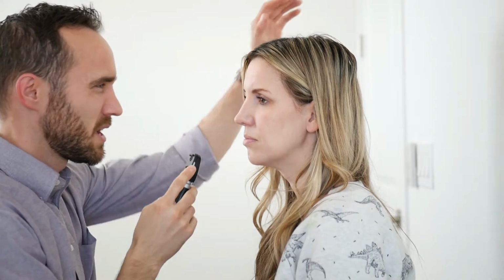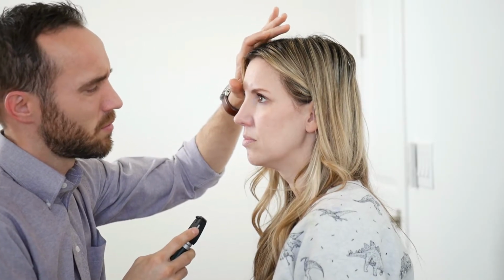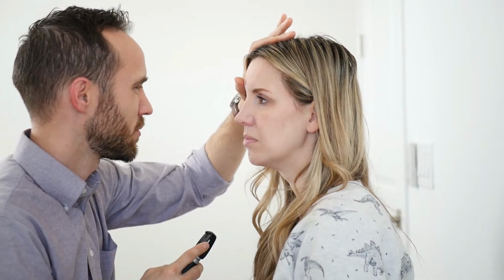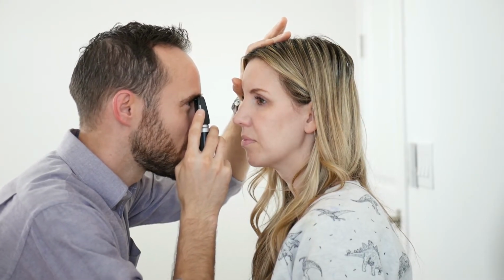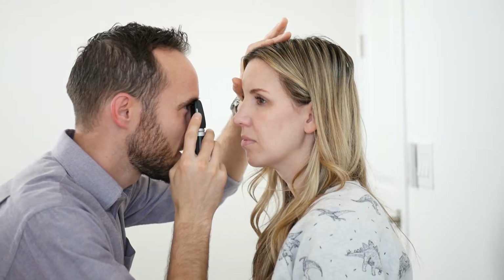So at that higher diopter, I'm looking at the anterior portions first, and I'm going to cover the right side of her brow with my left hand, and I'm going to observe with my right eye. First, anterior portions, looking for lens clarity. Good. I'm seeing red reflex already, but you can stand about arm's length away and find the appropriate diopter, and once you do, you'll see kind of a red, pupil-shaped coloration of red appearing in both of the eyes.